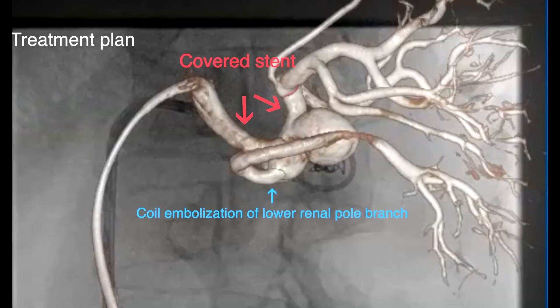We decided to place a covered stent extending from the mid renal artery into the outflow branch supplying the upper two-thirds of the kidney, and to perform coil embolization of the lower renal pole branch to avoid endoleak after successful aneurysmal exclusion.